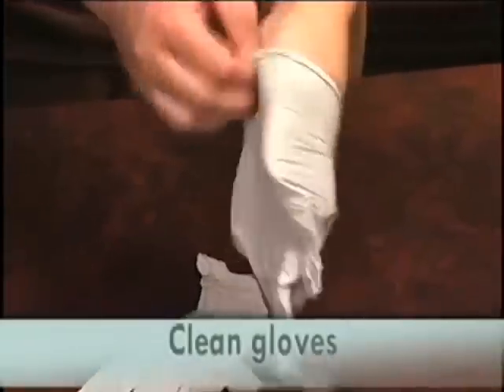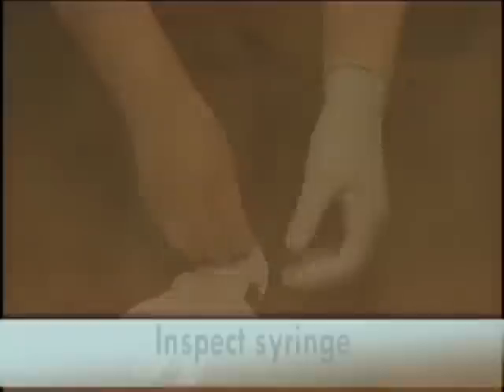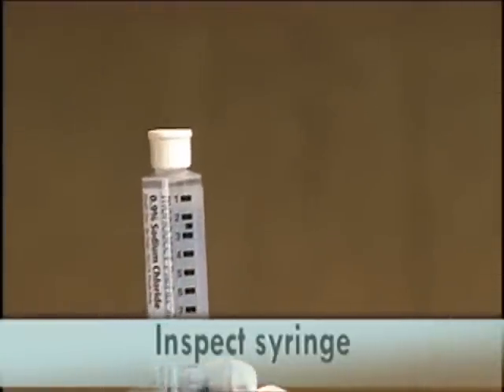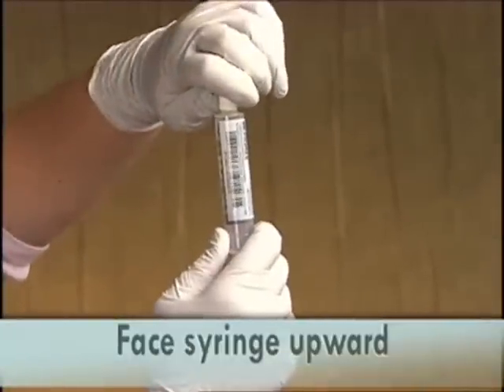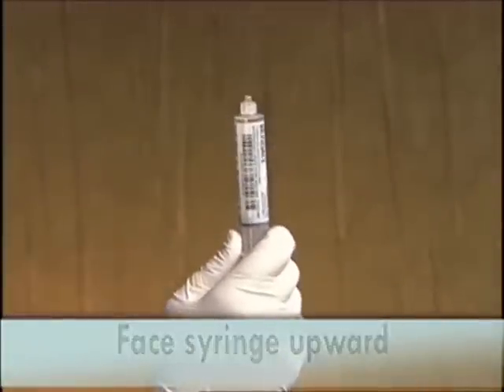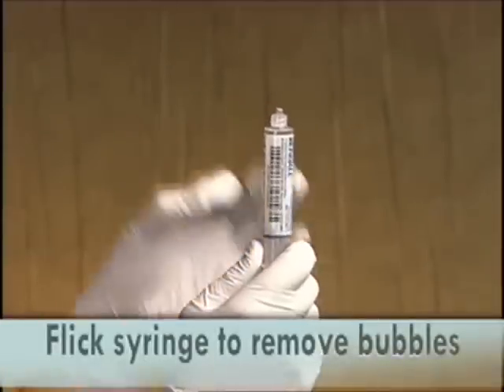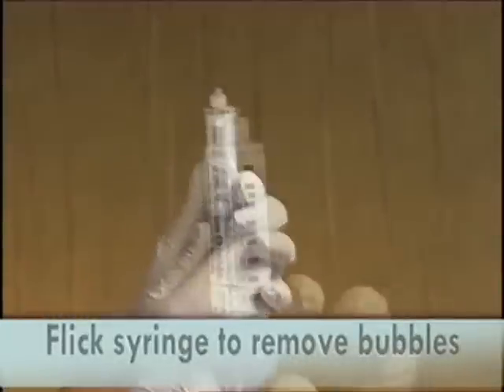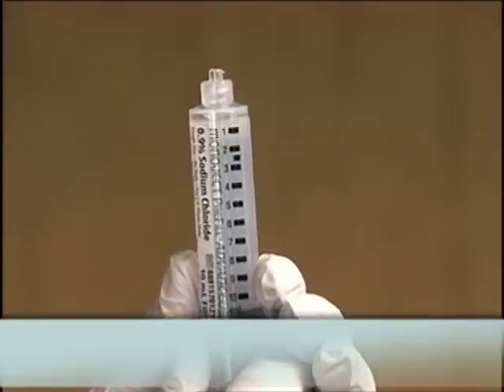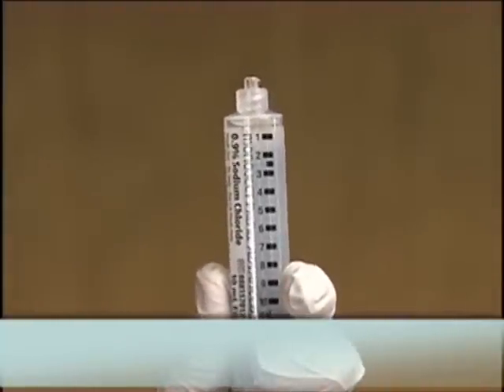Put on clean gloves. Inspect the syringe. Hold the syringe facing upward and remove the cap with gentle pressure. If there are bubbles, flick the syringe to remove as many as possible. Don't worry if a few small bubbles remain.